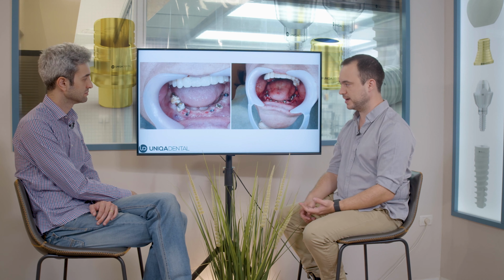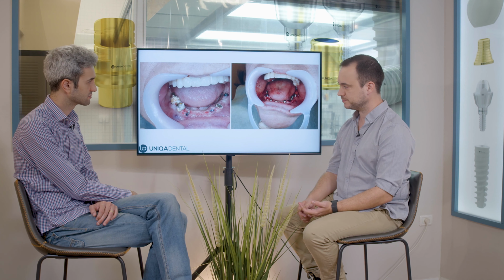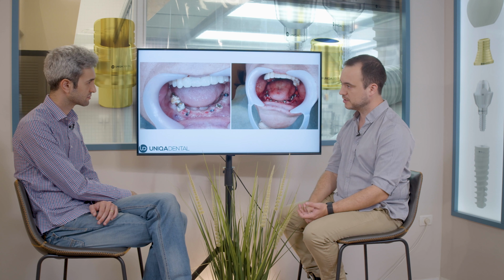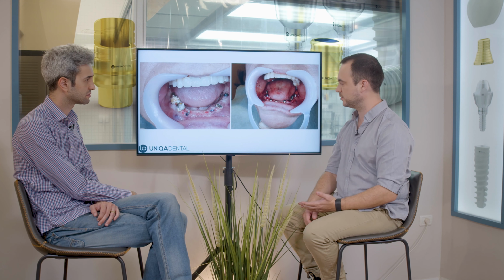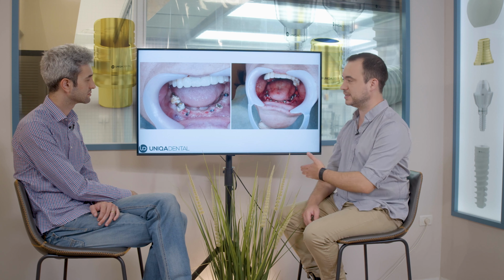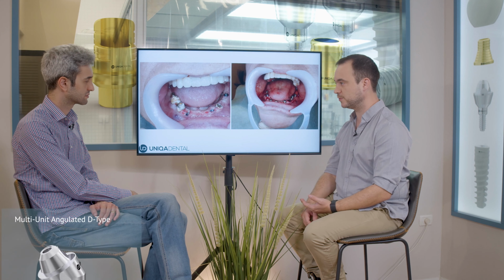In the second stage, we've added some implants around the extractions, and you can see that one of the implants is angulated. Because of the mental nerve, we want to go around the mental nerve, so the implant has mesial angulation, distal angulation. And we know that in this implant, we can have an angulated multi-unit that will correct the angulation of the implant, like in classic All-on-4.